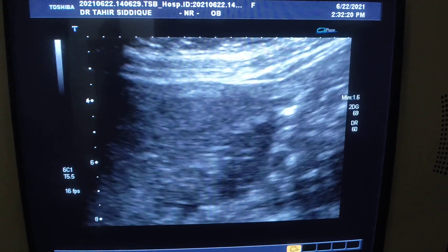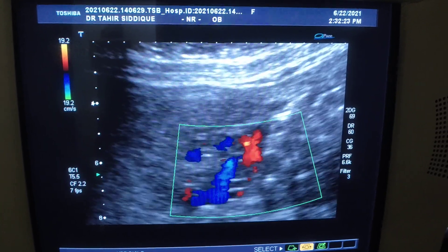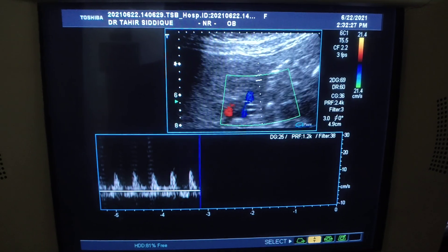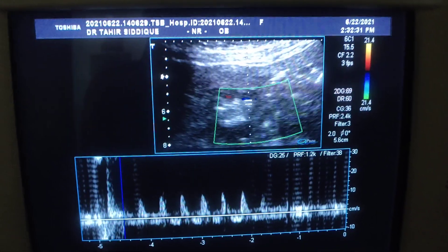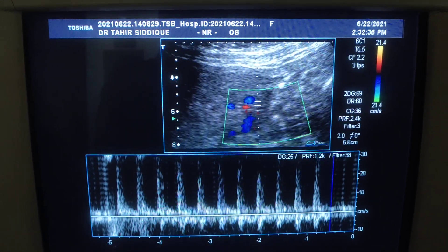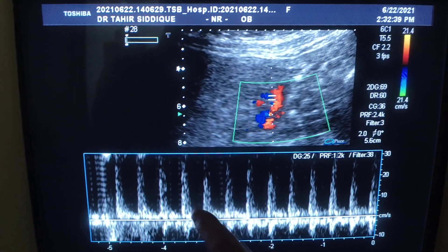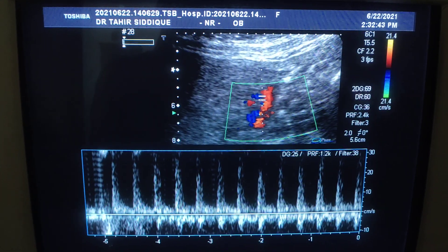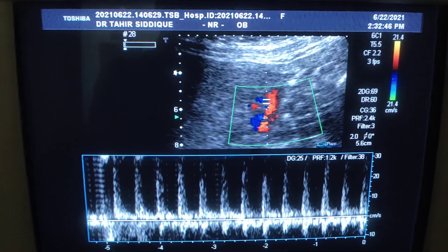Once again, to demonstrate the uteroplacental insufficiency: here you see the systole, and this is the end-diastolic flow reversal. This suggests uteroplacental insufficiency at this moment.